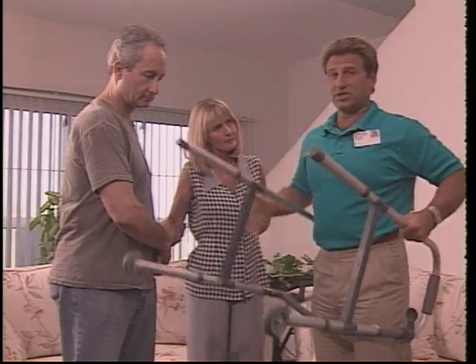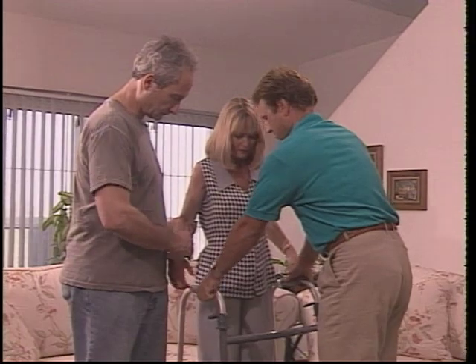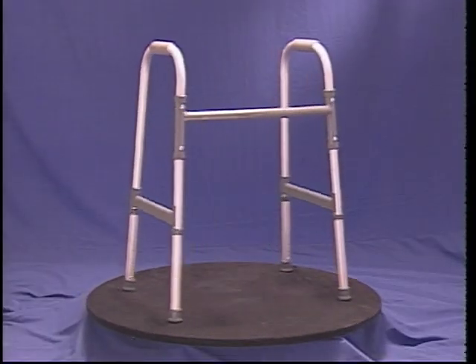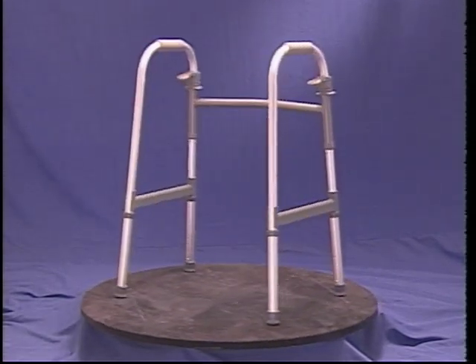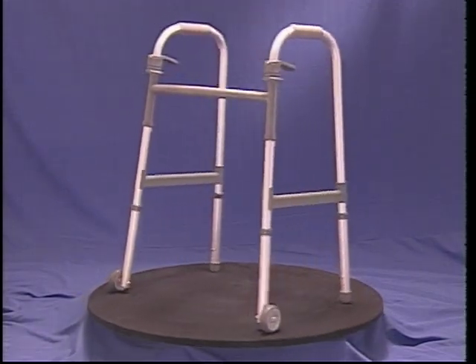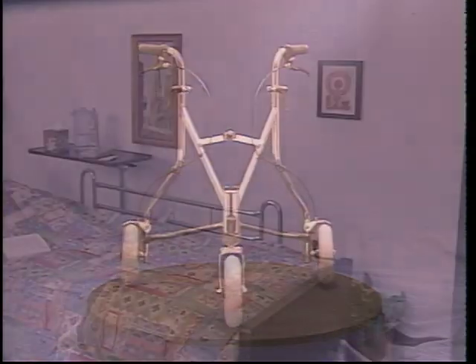Of course, the patient has to have good balance and coordination to make use of the walk aid. Okay, how's that? Great. Walk aids come in several variations: the standard pickup or rigid walk aid, the folding pickup walk aid, and either can be fitted with wheels to make the rolling walk aid. In addition, there are 3- and 4-wheeled walkers called rollators.